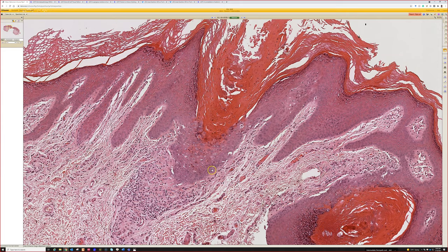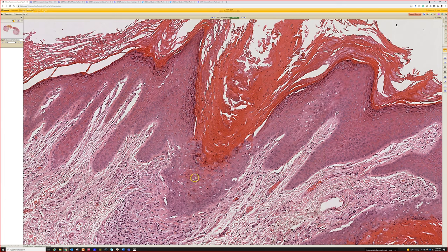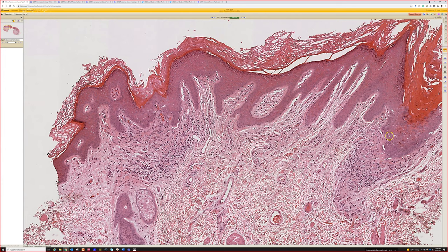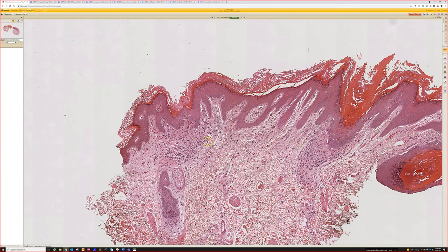Here's another, more subtle cornoid lamella — there's the parakeratosis and the little dying keratinocytes and vacuoles. A lot of times you'll see a lot of unusual changes in the dermis under the porokeratosis, particularly in a regular poro where it's a ring — in the middle of the ring you'll see fibrosis, interface change, lymphocytes, all sorts of stuff. And when you go out beyond the ring, the dermis turns normal again. They seem to not only have an impact on the epidermis but also alter the dermis underneath as they spread outward, making reactive changes, sometimes vascular changes that look almost like stasis. Very strange, very interesting diseases — porokeratosis.